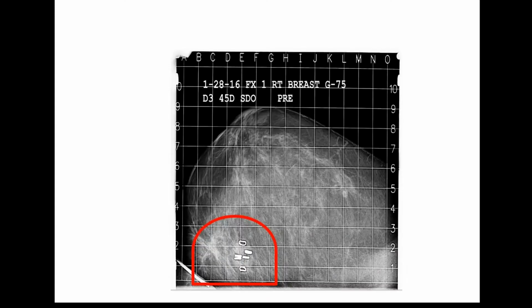Next slide. Inframammary fold location, again, is another area that I think is very delicate to bring an electron beam in, and often results in some less than ideal outcome related to toxicity in this location. But AccuBoost can quite effectively target at this depth.